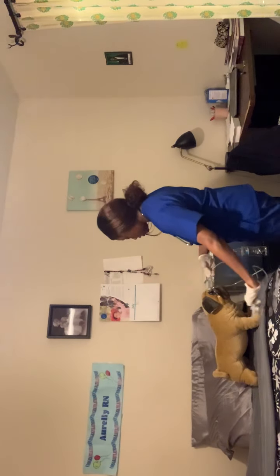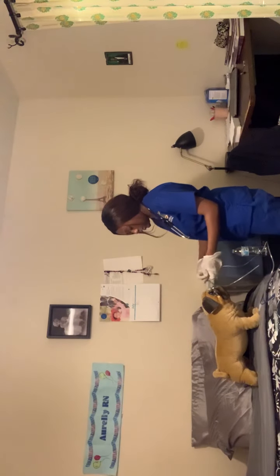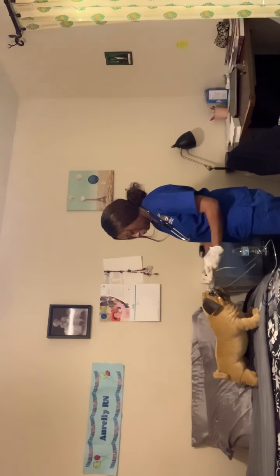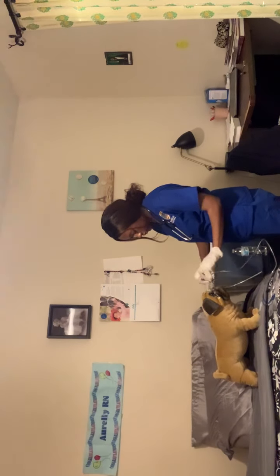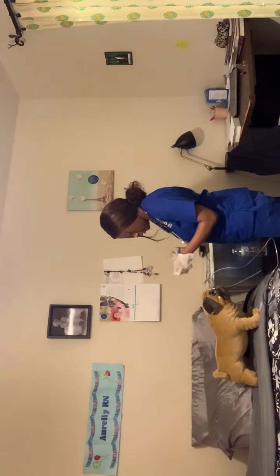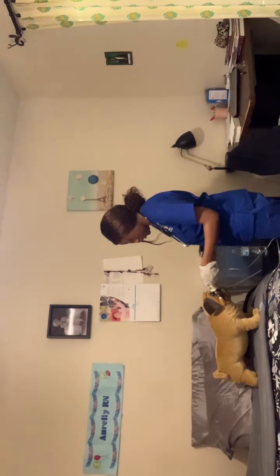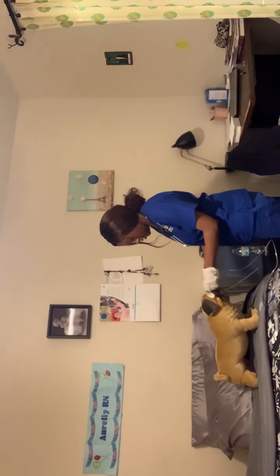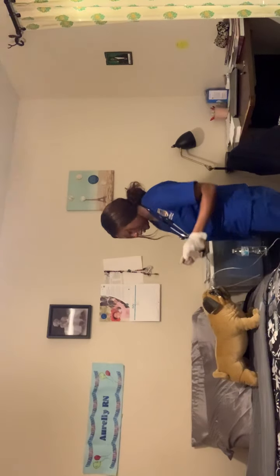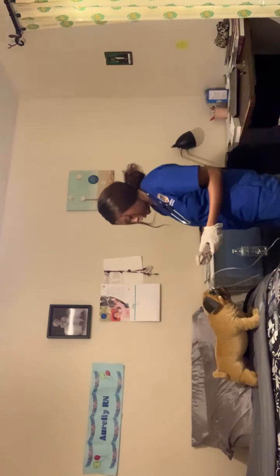Okay, I see that I reached the point. I would go ahead and anchor it with a piece of tape. Okay, I anchored it, and now I would put on a second piece of tape to anchor it.